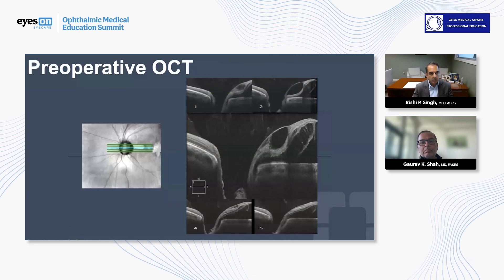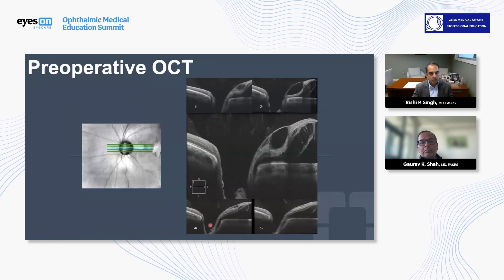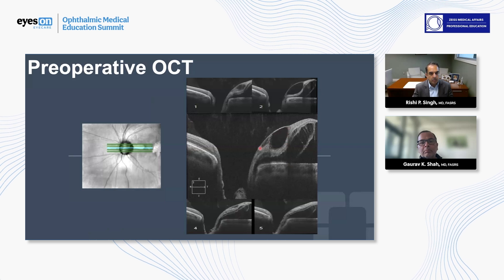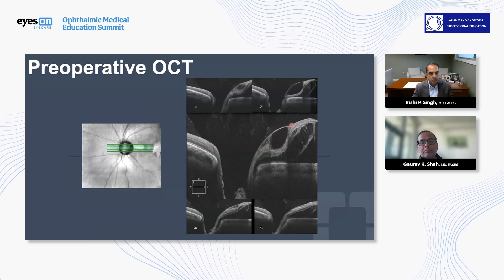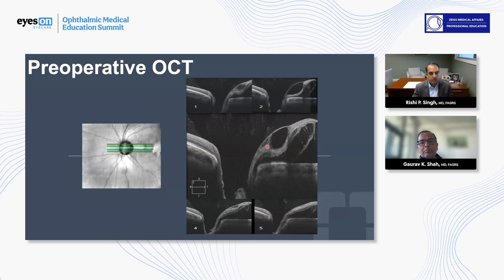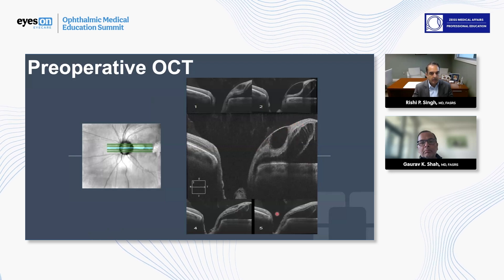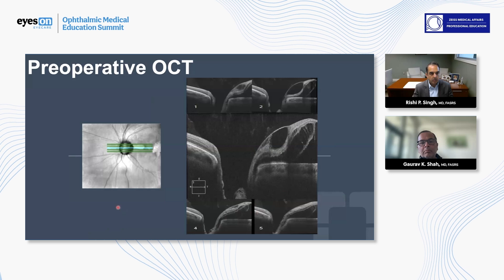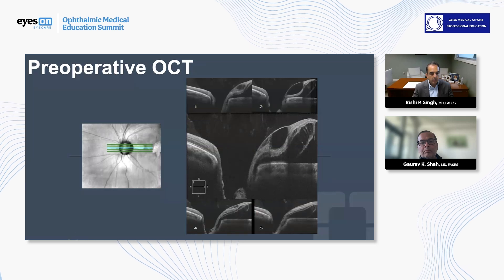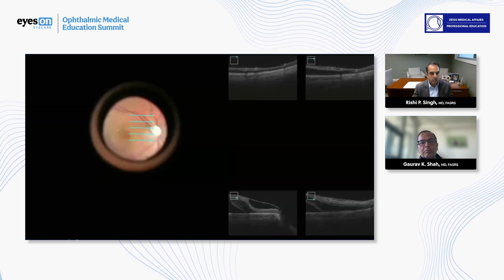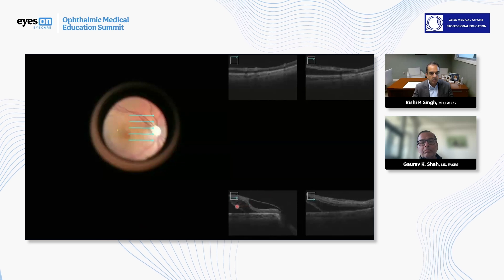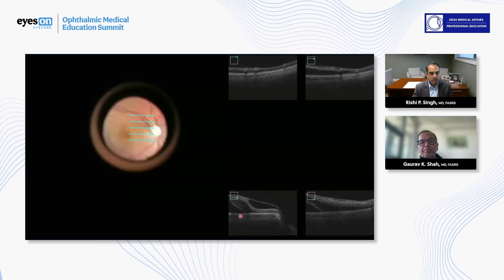This is the actual OCT before surgery. You have this membranous change right here, which may be hyloid, maybe ERM — it's hard to say, but we'll know when we do the surgery. Clearly, you have the macular views showing that retinal change as well. A couple of advanced photographs show there's a very thin retina right over that area.